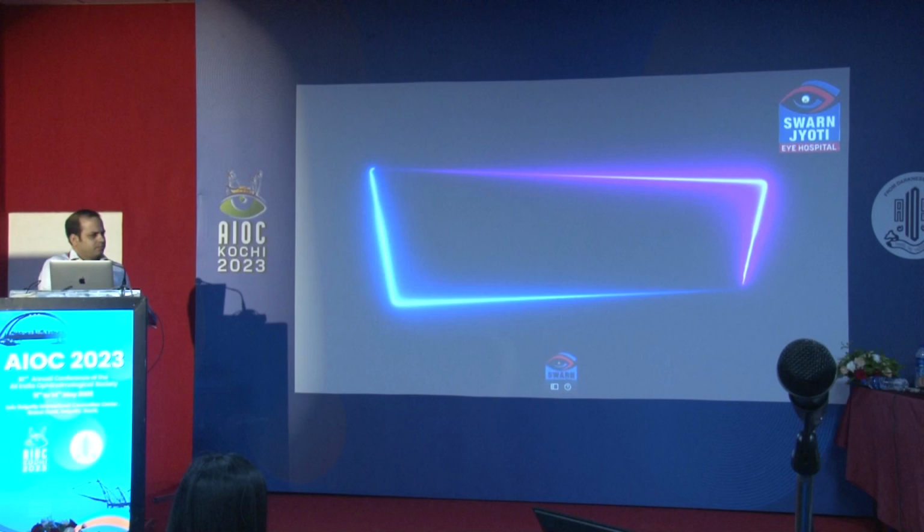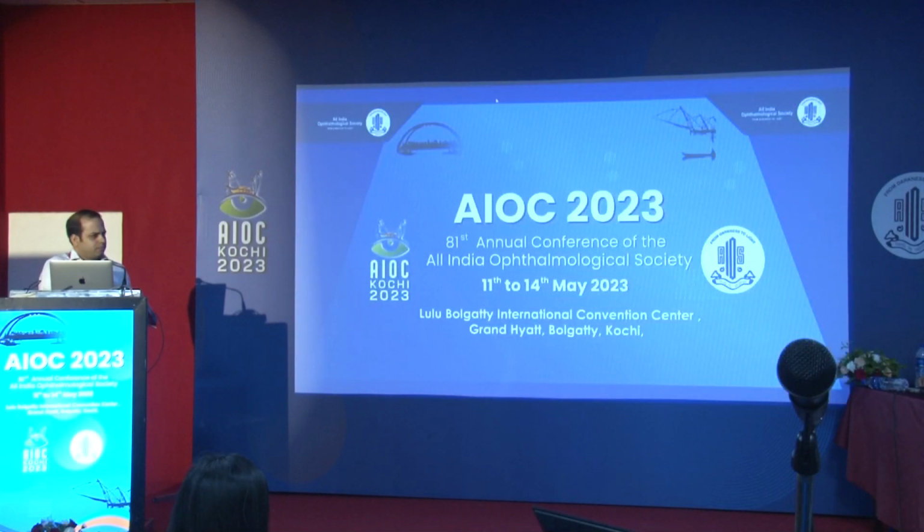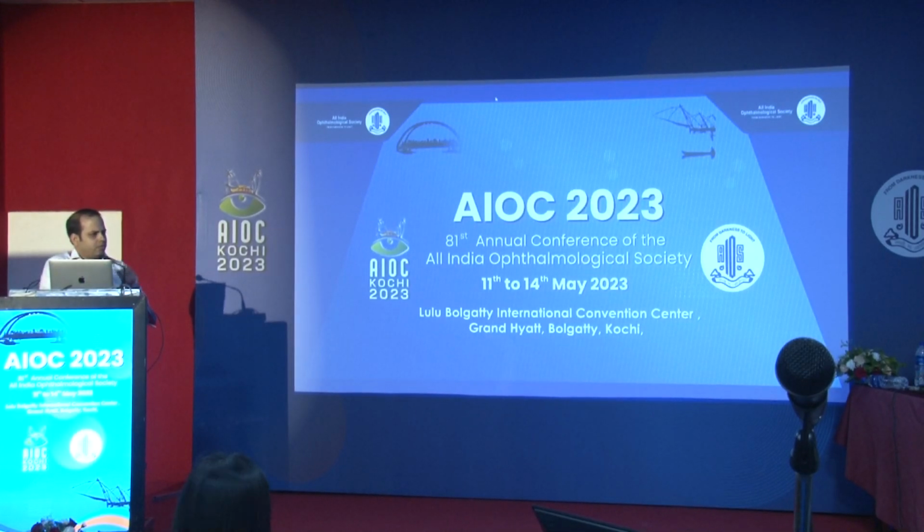So the preoperative cyst and intraoperative cyst were in the same location. So most likely the cyst was dead. That is what you think? No, because normally they keep on migrating. Because what we see in the OPD, and when you plan for surgery, the cyst may not be present at the same level. Sometimes it can go from subretinal to the vitreous space. Because it was a referred case, it was almost within 24 hours that we operated the case. So it was almost on the same location. The only point is it was not dead, because we could see the movements.